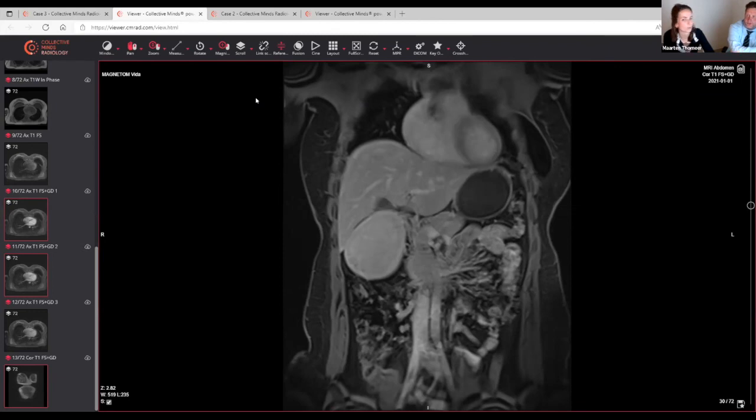But do you use fusion imaging? I don't think so. We don't use it in the clinical setting. We did some years ago, but I don't think we have clinical practice on that anymore. No. Okay. But it would be interesting if we have to biopsy certain parts of lesions.